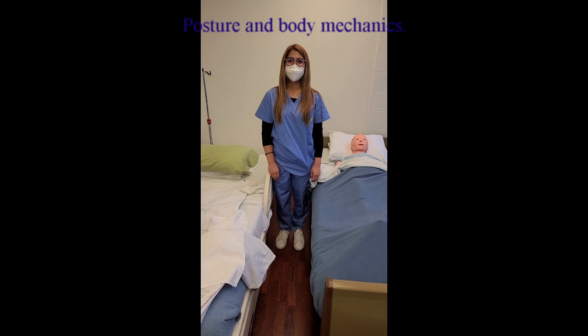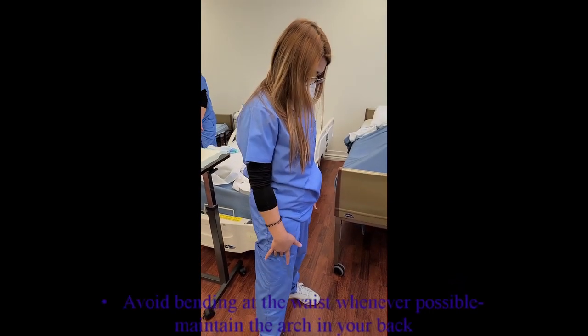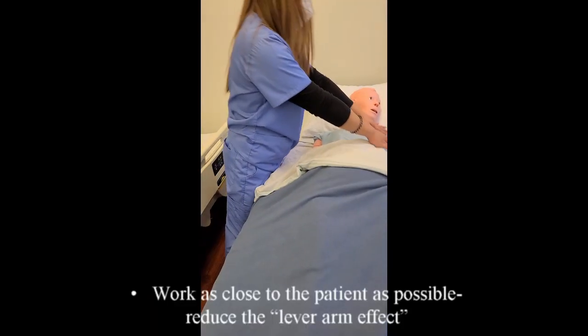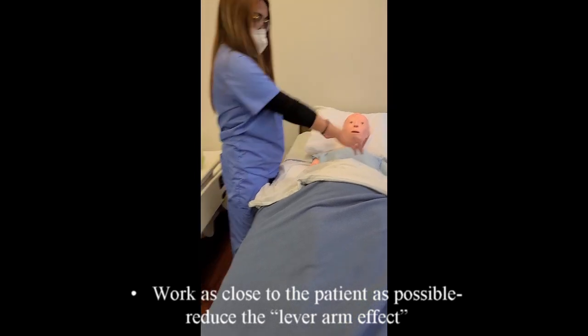Posture and body mechanics. Avoid bending at the waist whenever possible. Maintain the arch in your back. Work as close to the patient as possible. Reduce the lever arm effect.